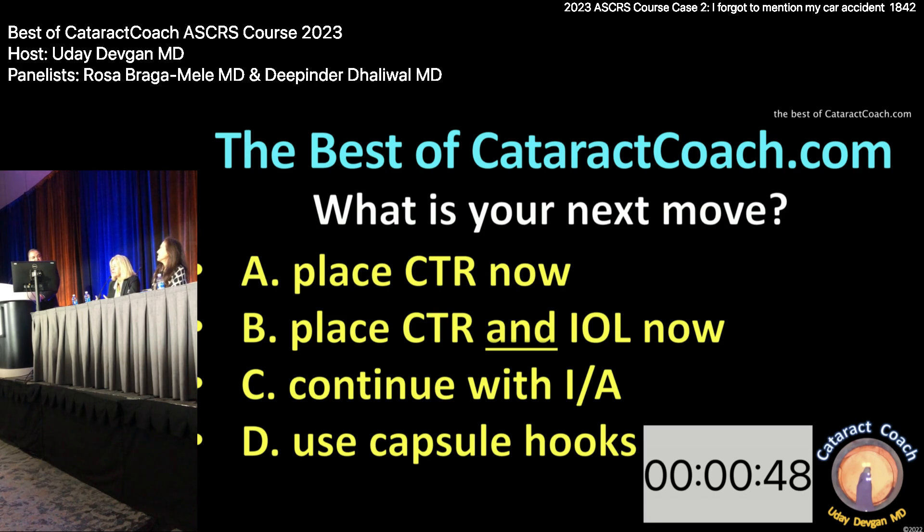Use triamcinolone, then after taking the cortex out, check what the pupil looks like and do a Weck-Cel sponge test to see if there's any vitreous to the wound. Maybe put in some Miochol to bring the pupil down. If no issues, it's still okay to do the EDOF lens if we have the CTR in. I think a three-piece isn't necessary — it's only a couple of clock hours of zonular dialysis. Put the CTR and IOL in — don't put the haptics in that area.